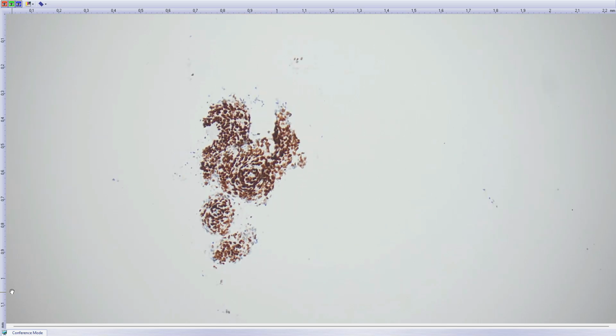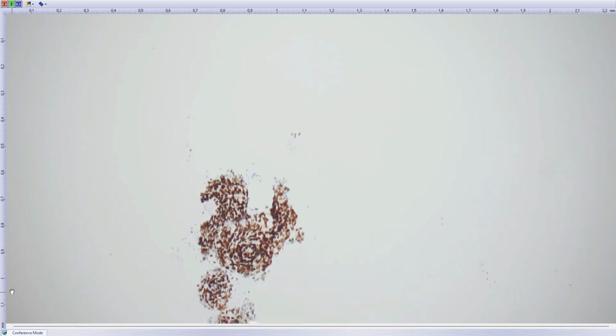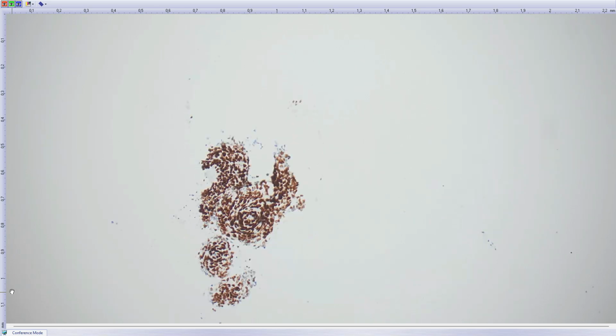So the lesion is diffusely P40 positive. There was also P63 positivity and focal cytokeratin 5/6 positivity and diffuse P16 positivity. So it must be basaloid squamous cell carcinoma metastatic to the eye. I also performed HPV testing, which came back negative.